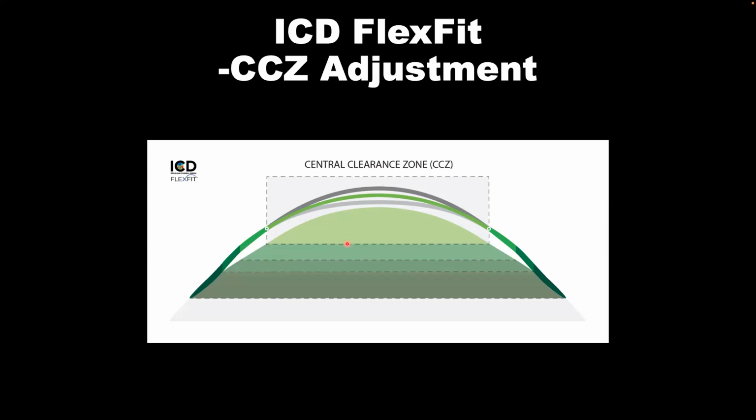Basically, what is suggested is that changing the base curve will be greater or well done when you are seeking to change over 200 microns. Less than that, you can do it with the peripheral curve. That will be the go-to modification that you need to do in order to change the central sag. And that wouldn't affect the power of the lens, sorry.